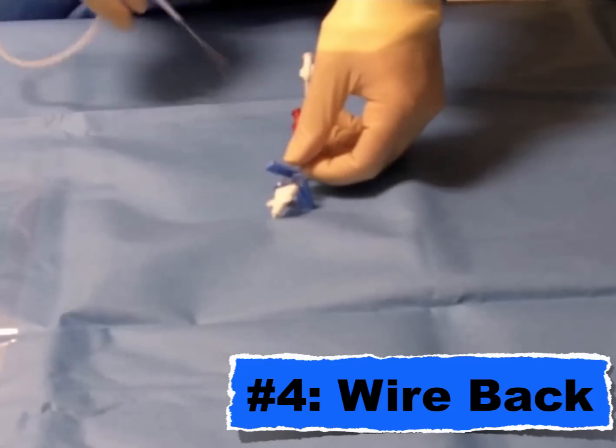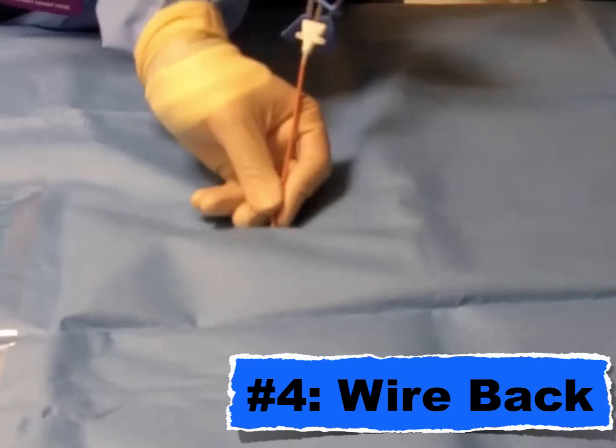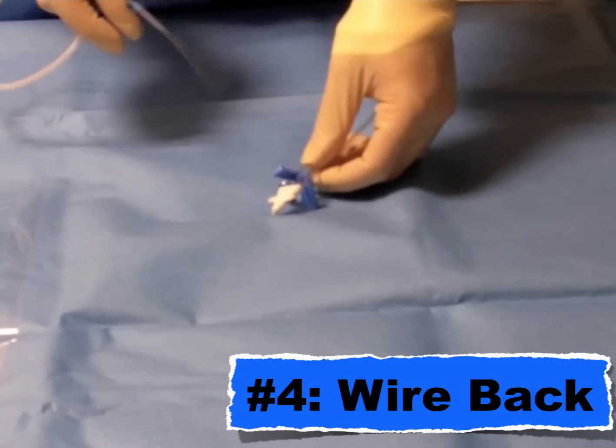If you don't need the central line anymore, they can take that thing — it's compartmentalized — and throw it in the garbage. If you do need that wire again, then it's easier to deploy that wire one more time. So use that plastic container that the wire came with to dispose of that wire safely, as you see right here.